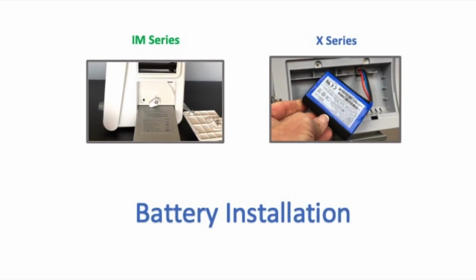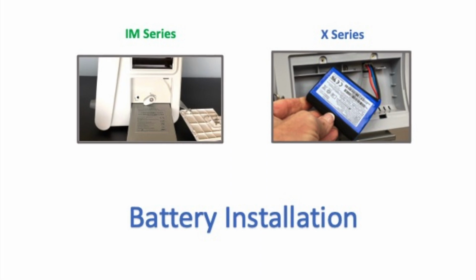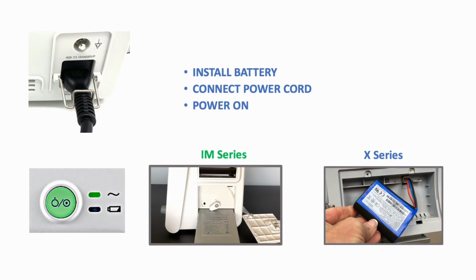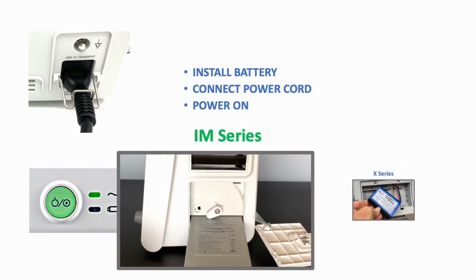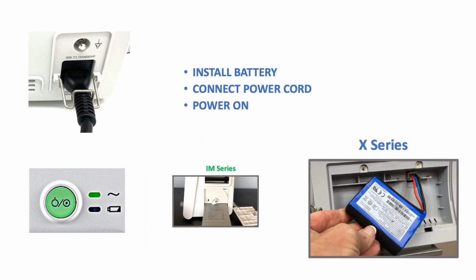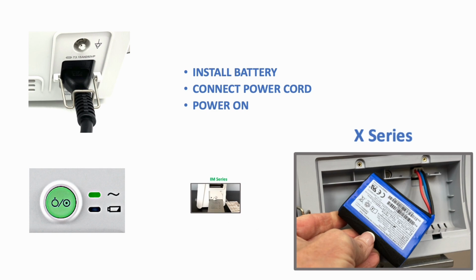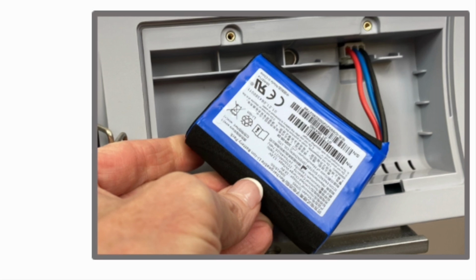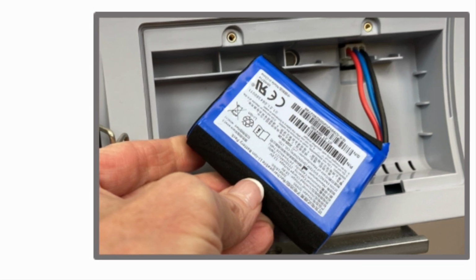Battery installation. The battery can be found in the foam packaging underneath the accessory box. To install the battery in the IM series monitor, locate the battery door on the right side of the monitor. With the label facing up, hold the lever over and slide the battery into place. For the X series monitor, remove the back panel with the provided screwdriver and plug in the connector as shown. Place the battery in with the label side up.